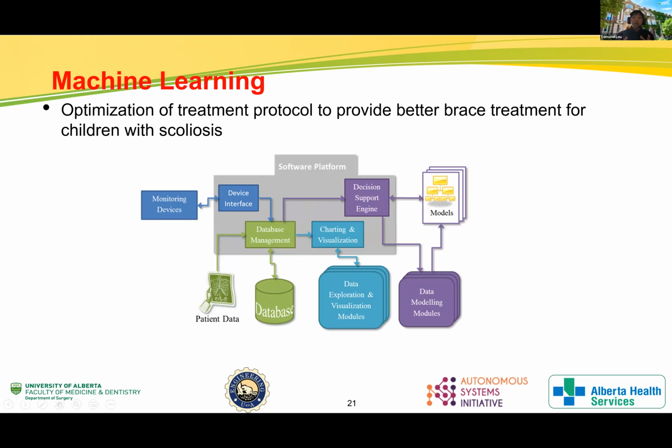So we would like to get the information and then provide the analytical engine so that the orthopedic surgeon or the orthotist can get this information and provide the optimized treatment protocol to the patient, so as to improve their quality of life as well.